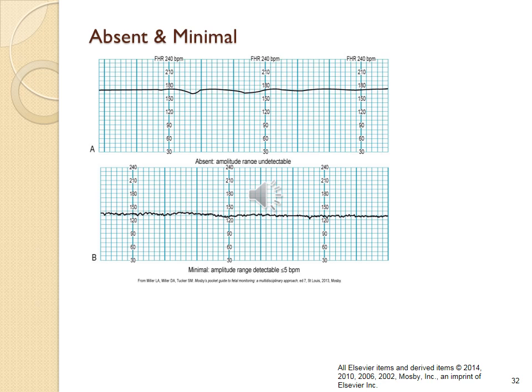Absent or minimal variability is classified as either abnormal or indeterminate. It can result from fetal hypoxemia and metabolic acidemia. Other possible causes are congenital anomalies and pre-existing neurologic injury. Central nervous system depressant medications, analgesics, and anesthesia may also cause this. See this information in your book, page 390.